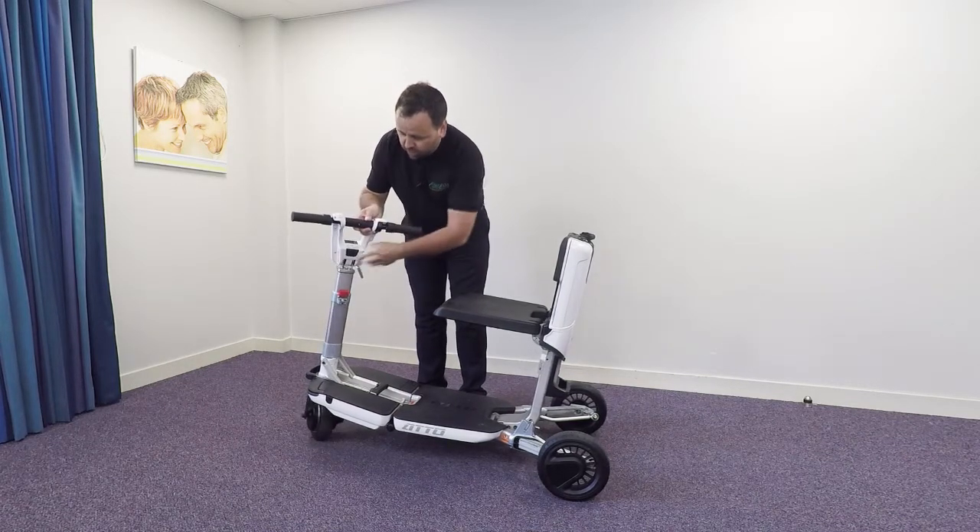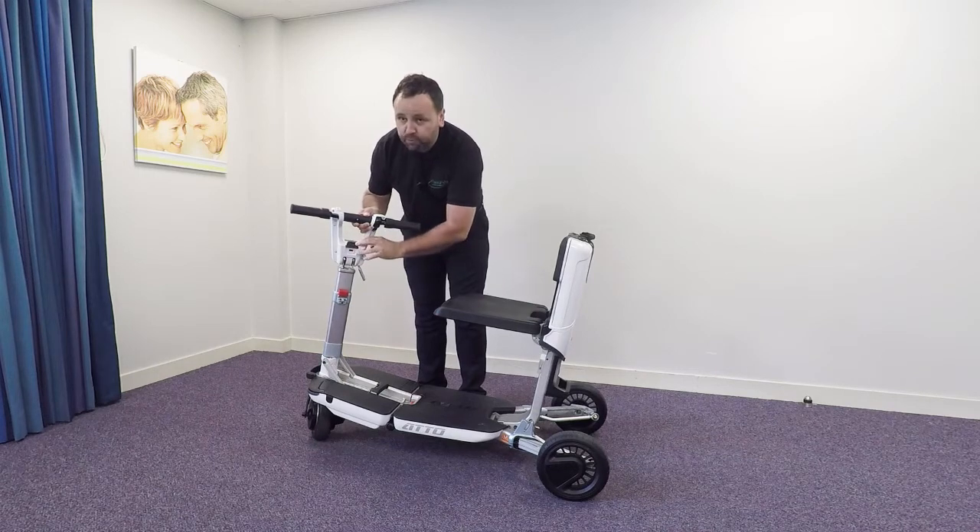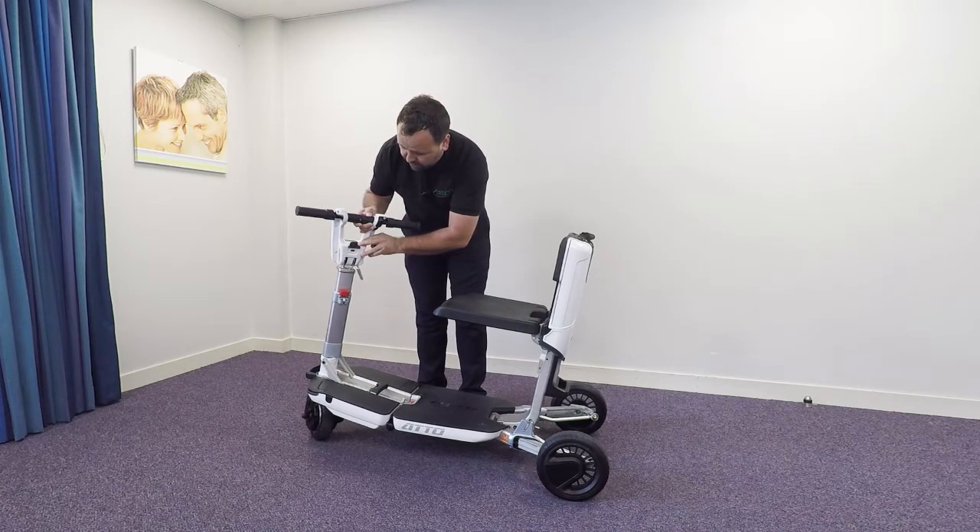The scooter is also fitted with a USB port, so ideal for anybody that has mobile phones or any devices that wants to charge.